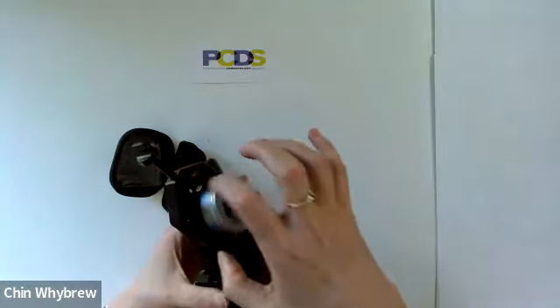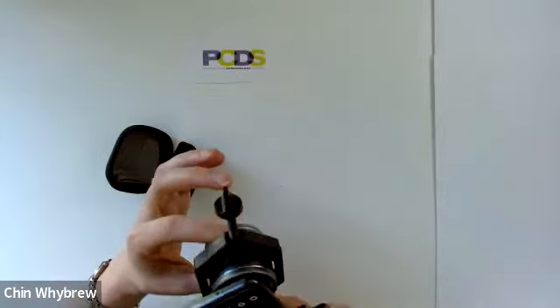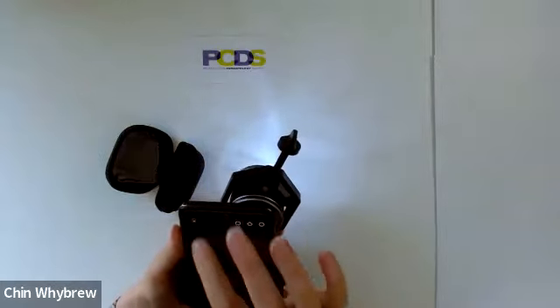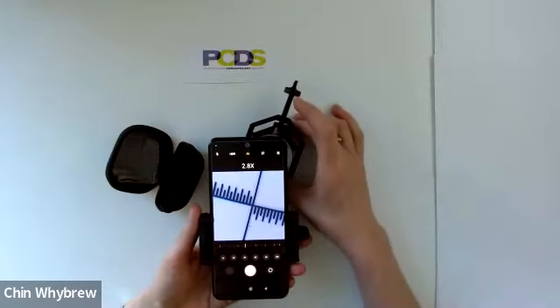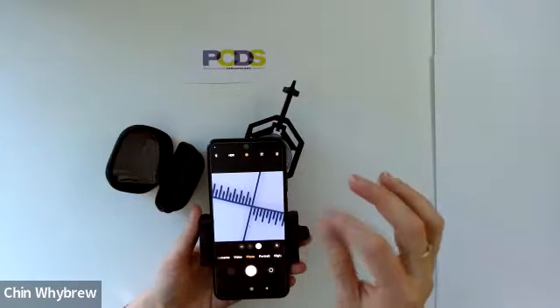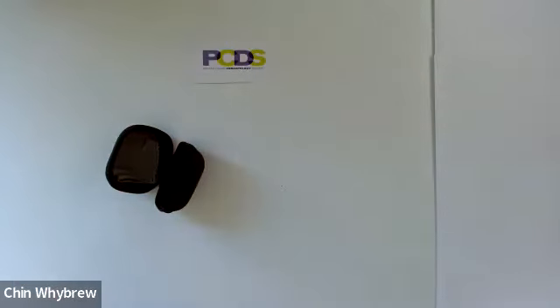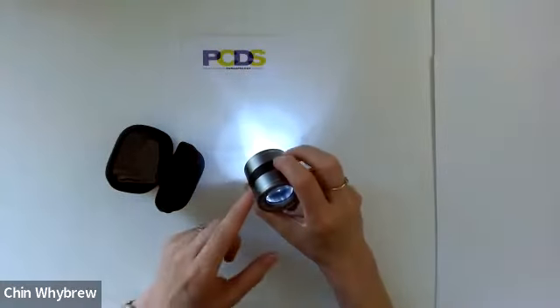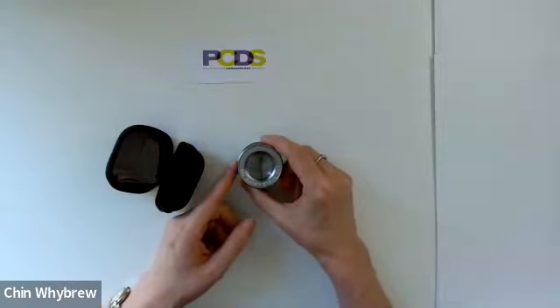We can still access the on/off switch there, and what we can do now is turn it on, position it, and take our photo. Remember that if you are using this as a dermatoscope you must use contact fluid, because this is non-polarised light — so for non-polarised dermoscopy you will need contact fluid before you take your picture. You can then press the button for ultraviolet mode and press it again to turn it off.